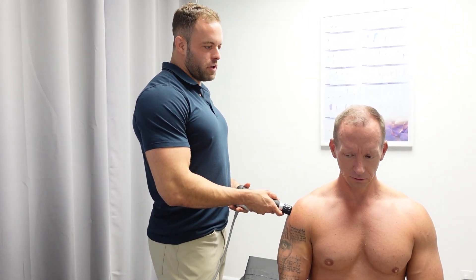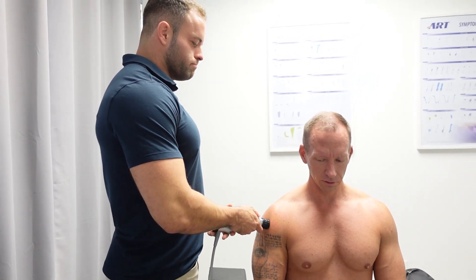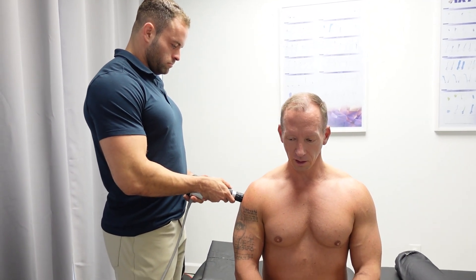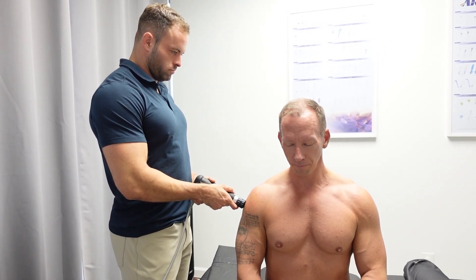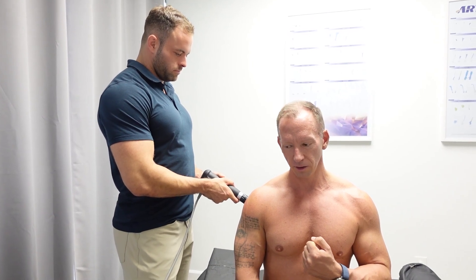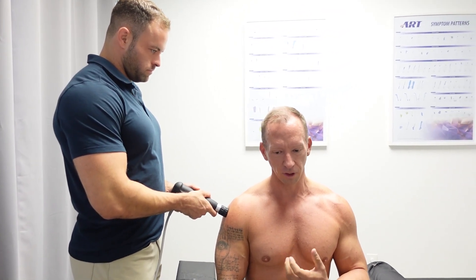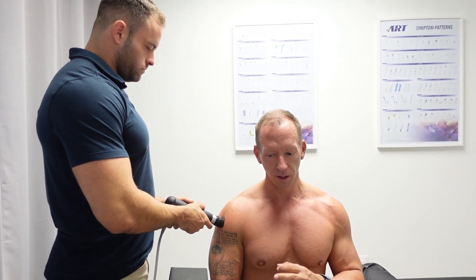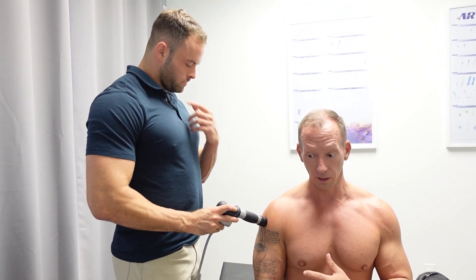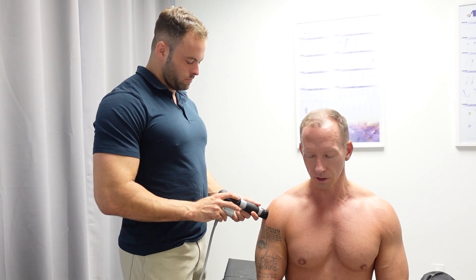So Dr. Eric, what are you feeling as I'm going through the area with the probe? Right there, definitely in the lateral deltoid, I can feel the most pain — I would say it's pain, but it's just a hurt. It almost feels like a good deep massage. And then the other areas, I can feel it kind of like beating on it. It's crazy because you can feel certain areas where it's different, and then it really ramps up in certain areas.